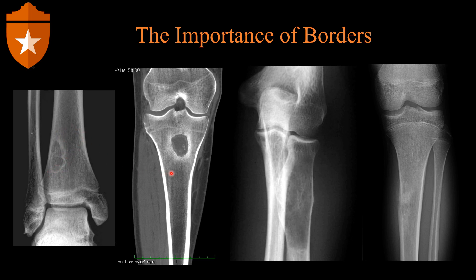Moving to the second image, we have a coronal reconstruction of the tibia showing a well-defined lesion — you can still trace a pencil around it. However, unlike the non-ossifying fibroma, the sclerotic border here is very thick, and as you move away from the lesion it becomes less sclerotic. This is intermediate in aggressiveness — the lesion is active but not aggressive. The osteoclasts are still eating bone, but the osteoblasts have had time to mount a response; they are still being recruited, which is why the border is so thick.